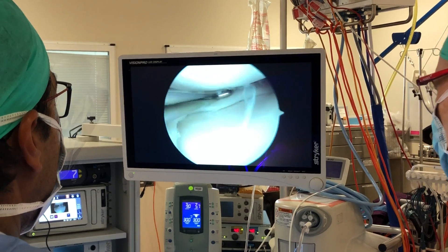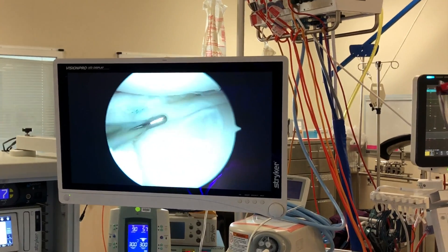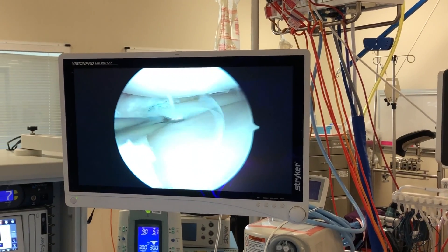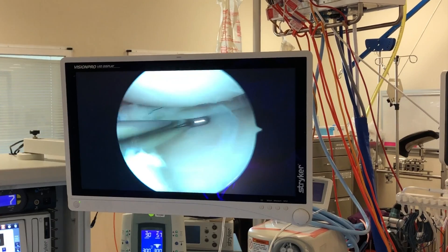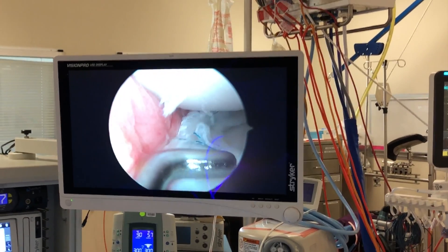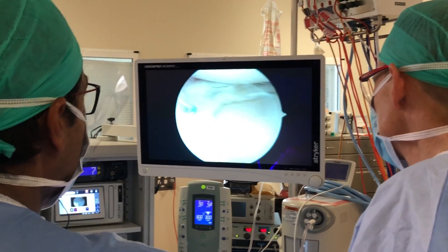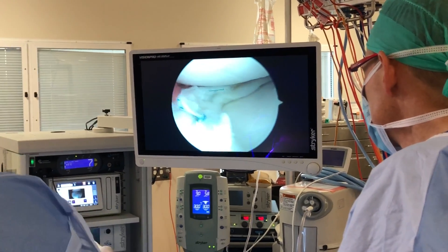Three anchor sutures — one here, one here, and one here — and you can see that it's nice and solid now, it won't come forward. This will allow it to heal. He'll be non-weight bearing for six weeks in a flexed position, and hopefully this will heal up and he won't have any issues.